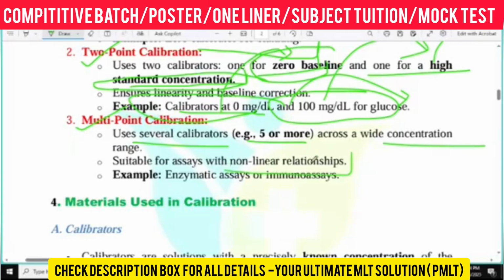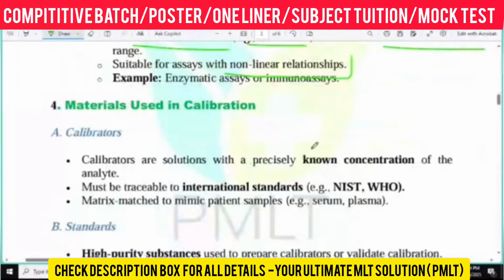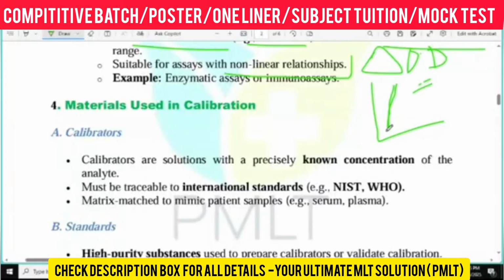Non-linear relationship, whenever I teach you enzyme kinetics, then we will understand. Non-linear relationship means when you are doing any kind of kinetic procedure like SGPT, SGOT, within the interval you have to measure the OD, right? That is Del OD, which defines that within this time interval you are getting the OD.